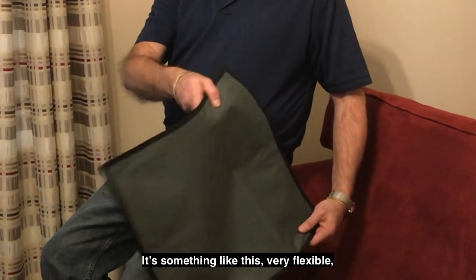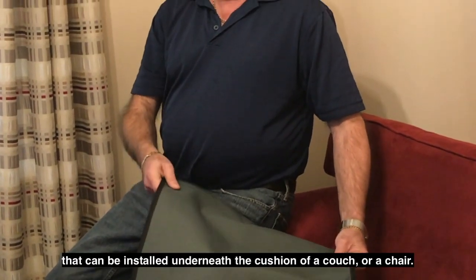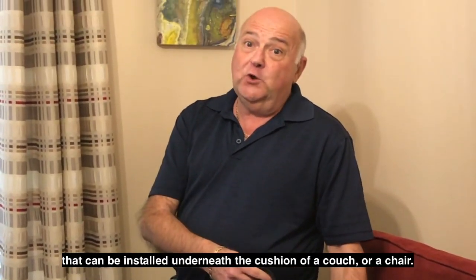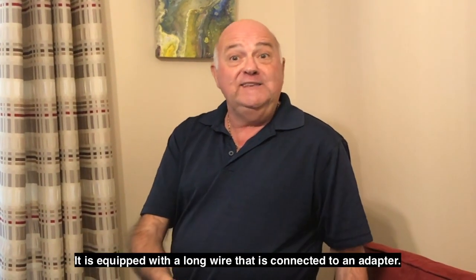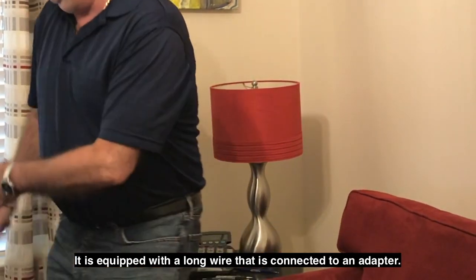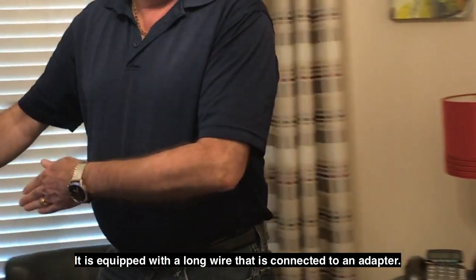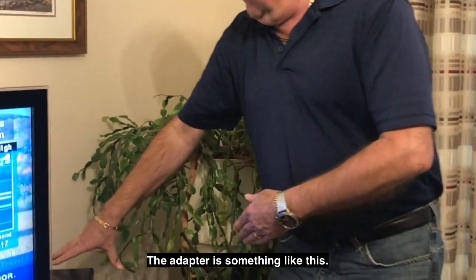It's something like this — very flexible — that can be installed underneath the cushion of a couch or a chair. It is equipped with a long wire that is connected to an adapter. The adapter is something like this.